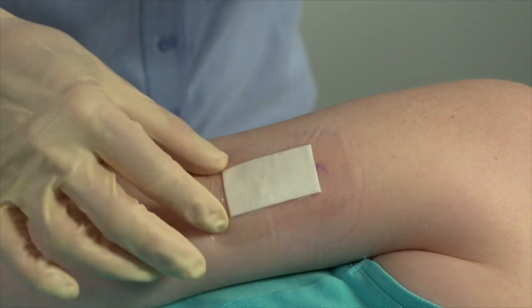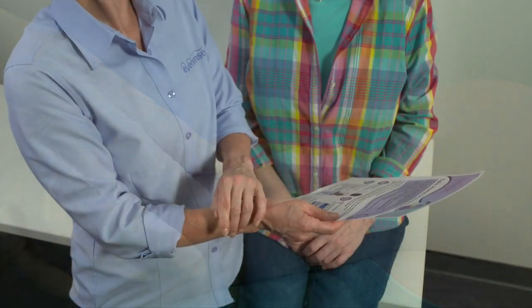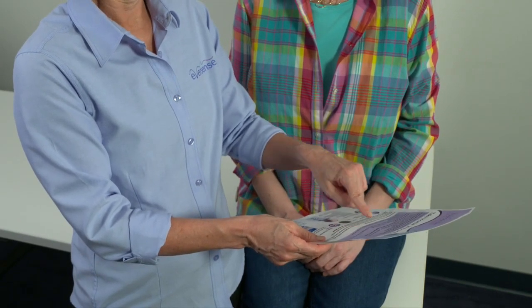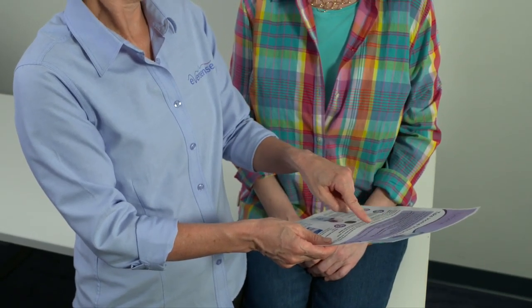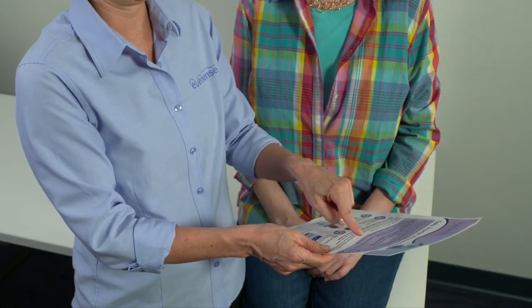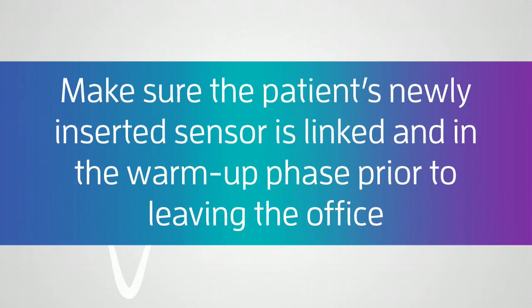You may now remove your sterile gloves. Instruct your patient on incision care and to call your office should any potential adverse events occur. Give the patient the written take-home instructions. And remember to make sure that the patient's newly inserted sensor is linked and in the warm-up phase prior to leaving the office.